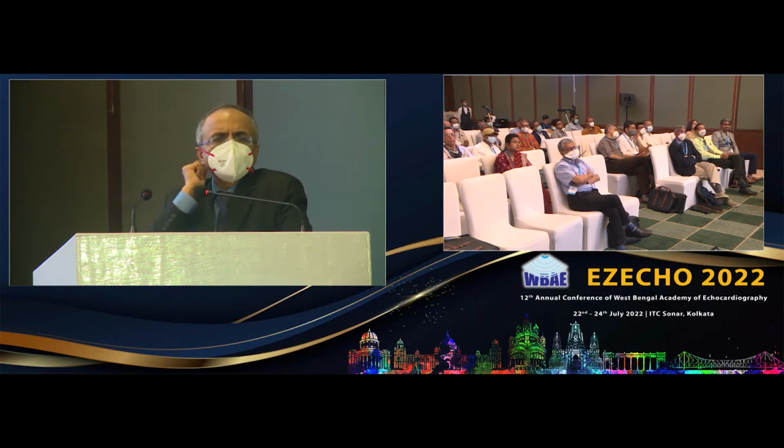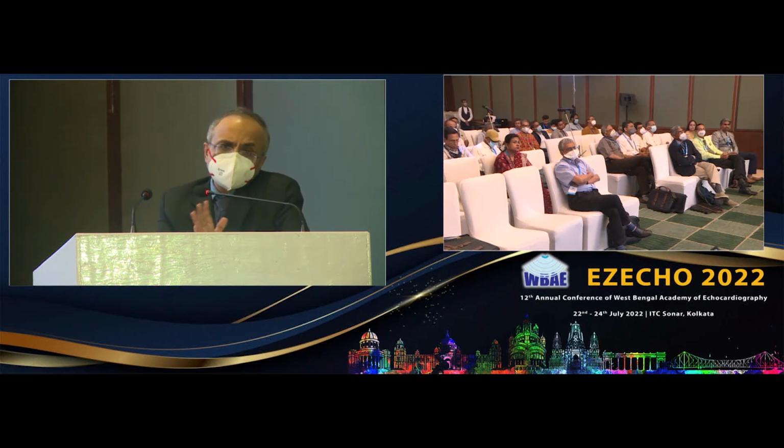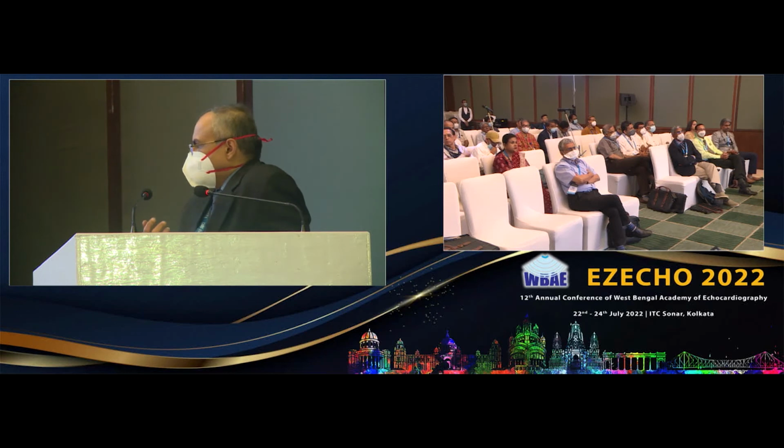And lastly, you have a patient with unexplained syncope, family history plus or minus, he had some sudden cardiac death, but was it really related to HCM? So you are not sure on those points to think about an ICD, and you want some booster for your decision of ICD, then you can look at the late gadolinium enhancement and quantification. Thank you so much. Okay, thank you.